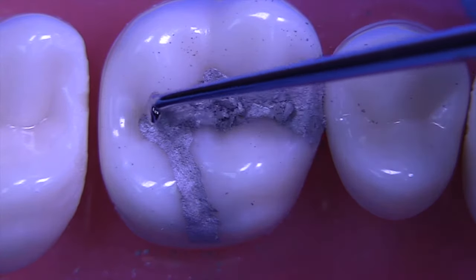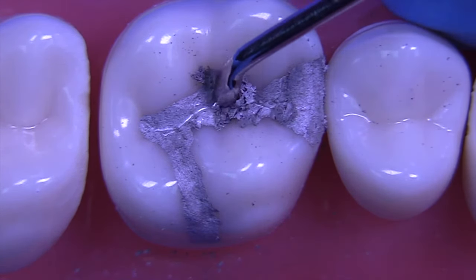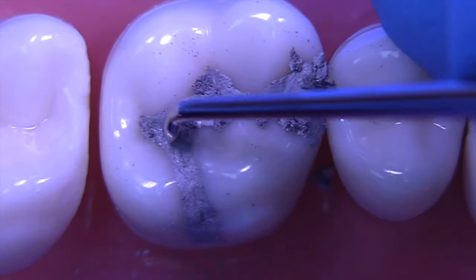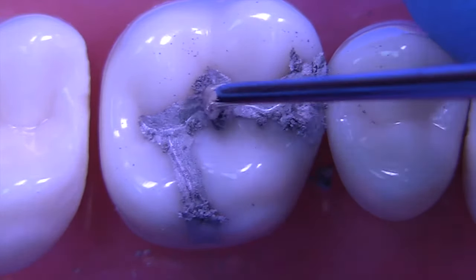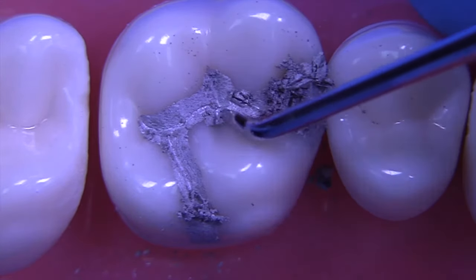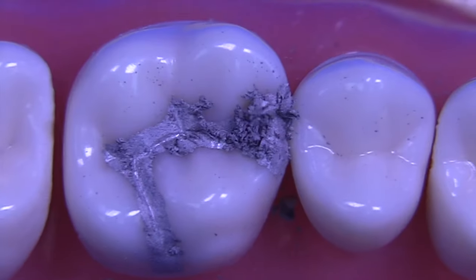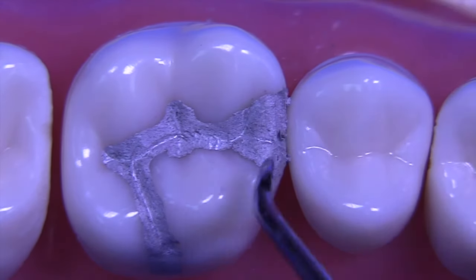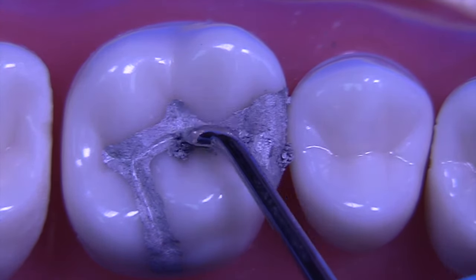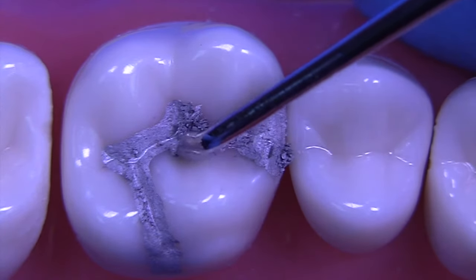There you can see that we had a pretty significant amount of flash that just got removed. Continue to remove flash as you carve the anatomy. Try to keep the central groove in the center of your amalgam restoration — after all, that was how you started this preparation. When the student performed this prep, she was very good at keeping the preparation centered over the original fissures and pits in this simulated carious tooth. I like to utilize a move to make the marginal ridge less bulky and also to create a V-shape as viewed from the mesial, so it becomes more like the natural anatomical form.